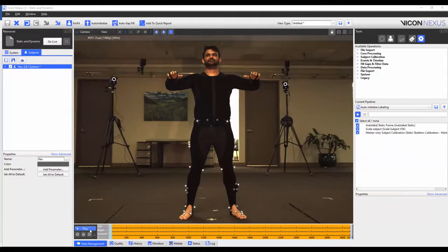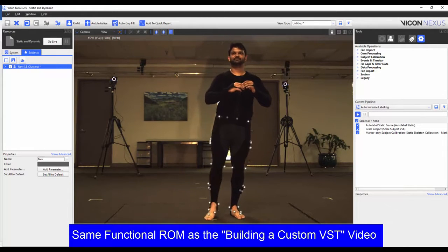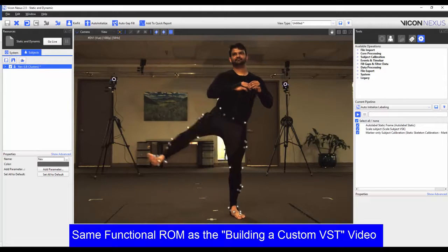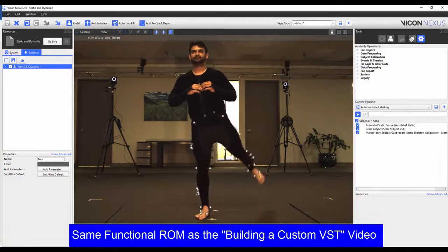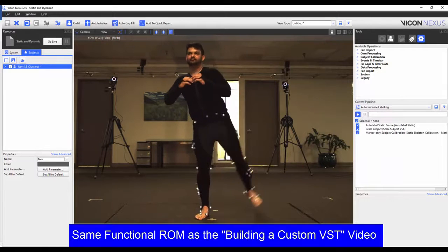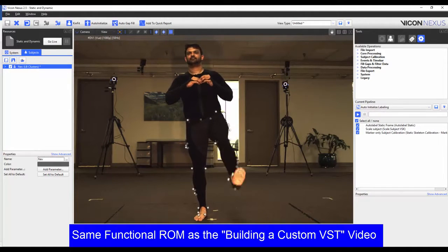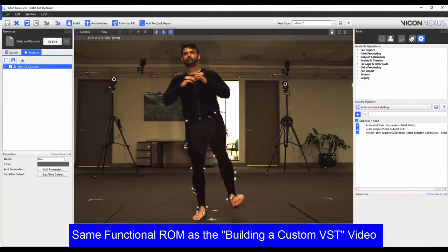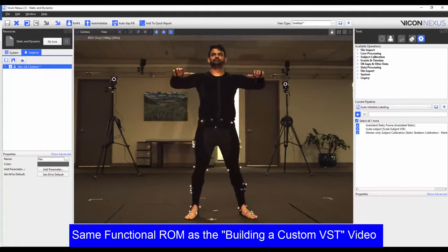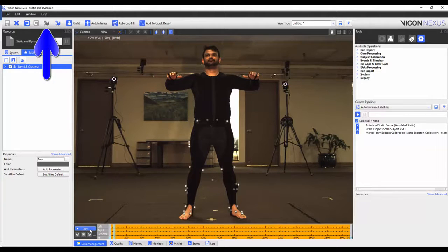In this video I have captured a trial where my subject starts off in the base pose and then goes through the functional range of motion, where the subject performs the star pattern with both hips, flexes and extends both knees, rotates the ankle joints, and then returns to the base pose. I've already loaded the trial from my data management and I have reconstructed the trial.